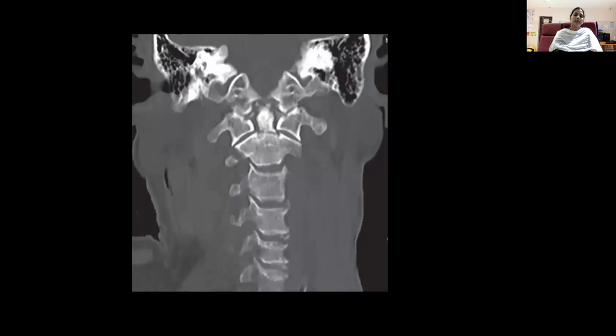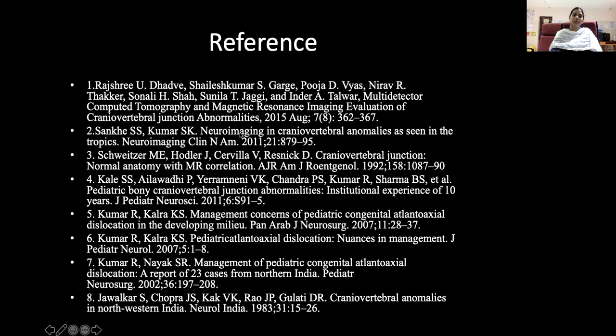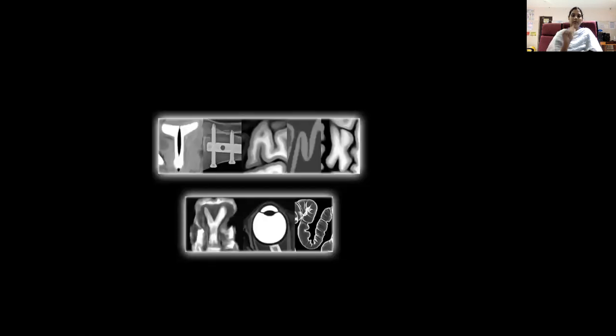This is a type 2 odontoid fracture. Thank you.